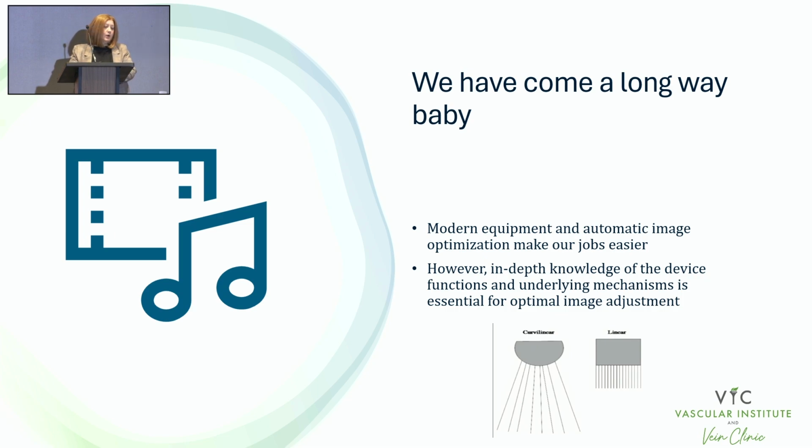So we've come a long way, baby. We have modern equipment and automatic image optimization that makes our job easier. I think on most newer equipment these days, there's an auto scan, or I can't remember what some call it, but it's the magic button where if you hit it, it just automatically optimizes everything. But you're not a good sonographer if you just rely on that.